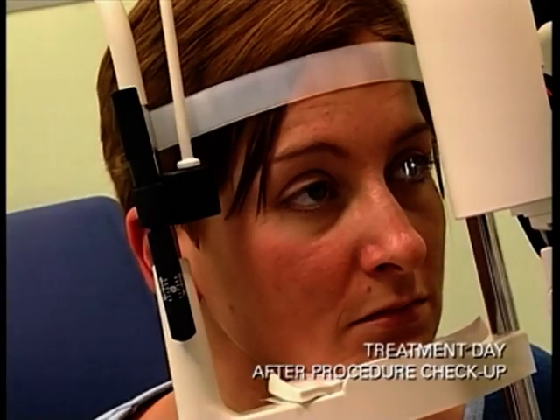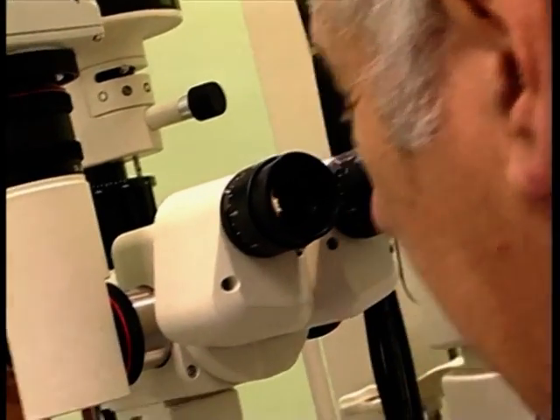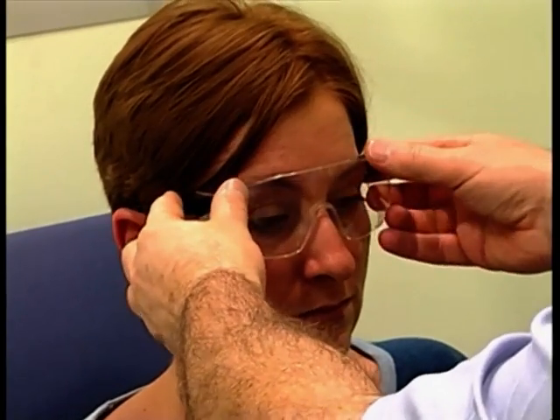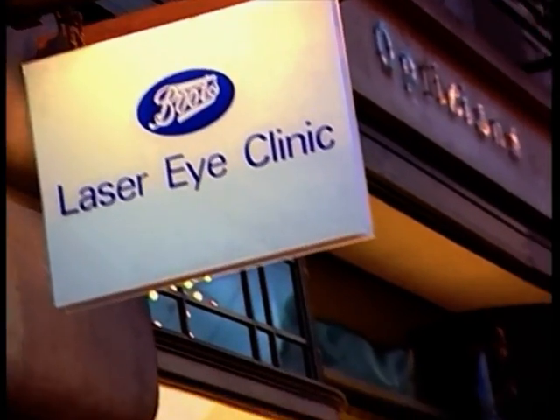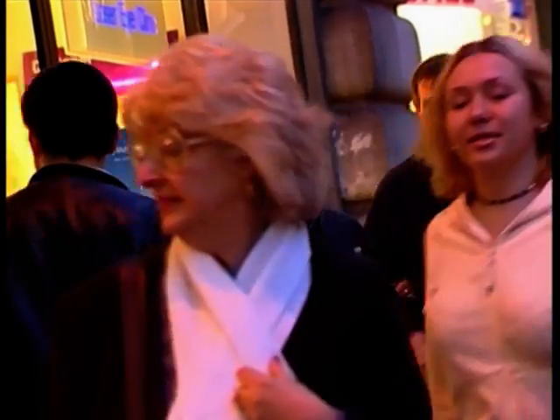Then Mr. Rosen checked my vision and basically told me I was free to go home and everything had gone really well. So what we need to do now is just pop your goggles back on to make sure your eyes are protected overnight. Thereafter you won't need these. And you need to use your lubricant drops several times. Immediately after surgery things are still a bit watery, and then just to compound that, put some plastic eye protectors over your eyes, and it probably feels gritty for a couple of hours, but the real staggering point is the following morning my vision was very good, and even more incredible was that I could not feel a thing.